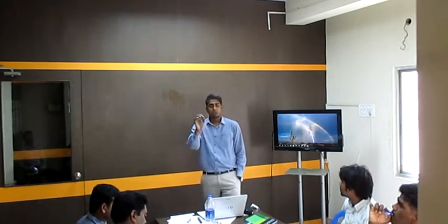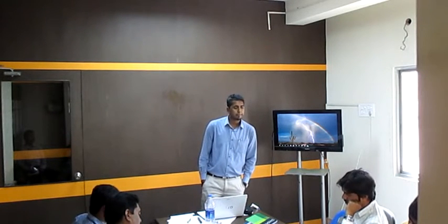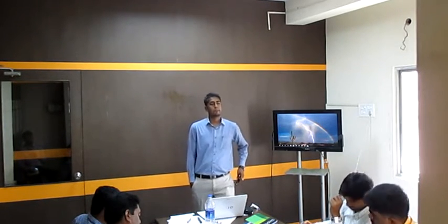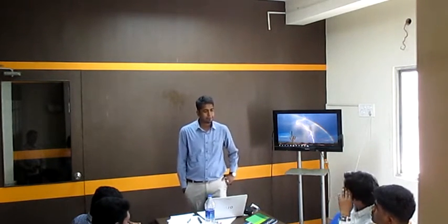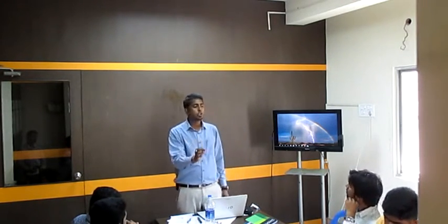So how many parameters are altogether? 5 or 6? I think 6. Speed of handpiece is first, torque second, pressure third, rate of cutting fourth, heat generation fifth. Okay, so these are the performance parameters. For any handpiece, this information you should have.